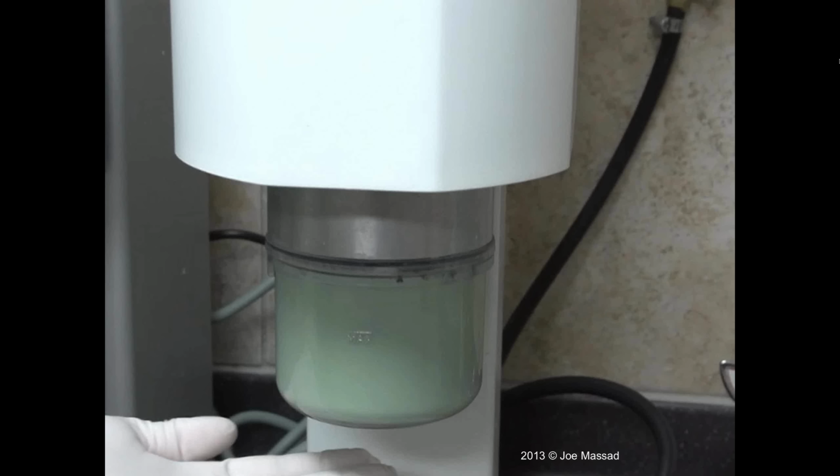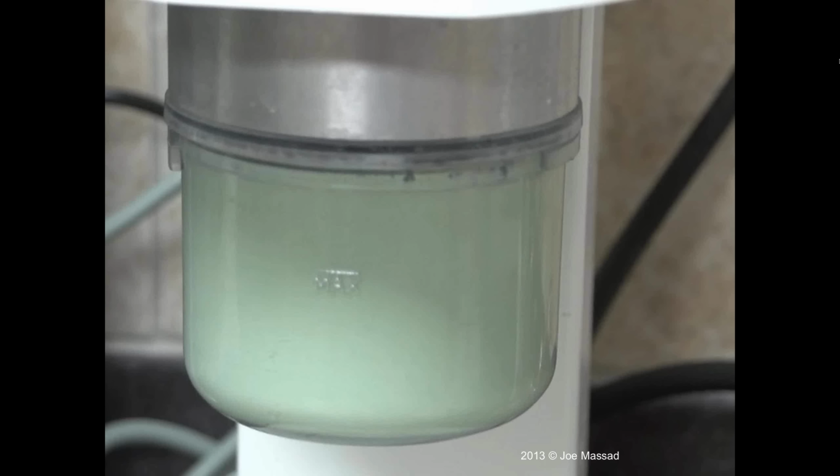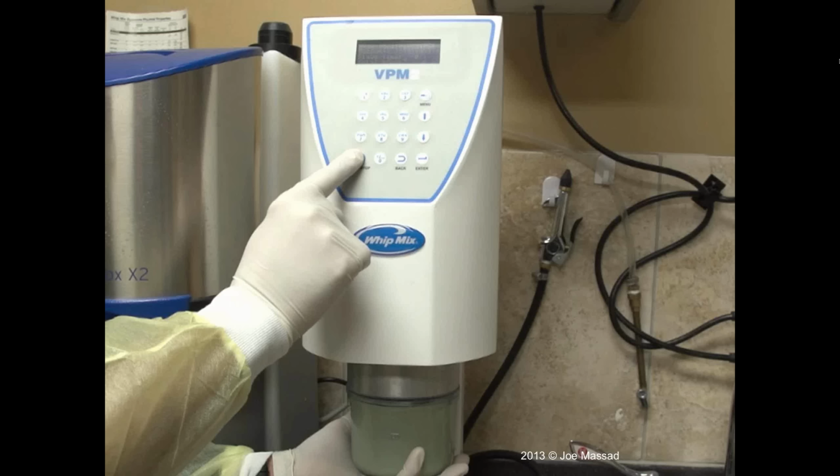And you could actually read the guidelines. Now, if you take a close look, I'm starting to leak a little bit on the bottom of that. You see, if you don't seal that off, you see where the liquid is, it could actually just come all the way out. So I want to emphasize you need to lock that in.